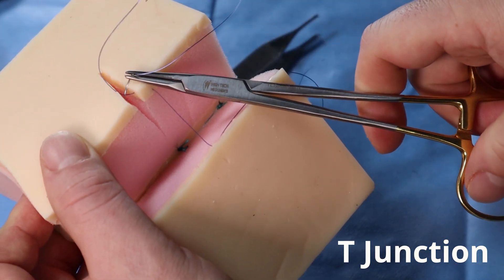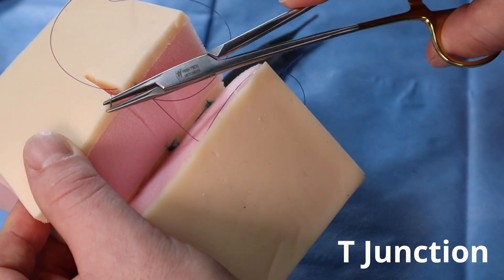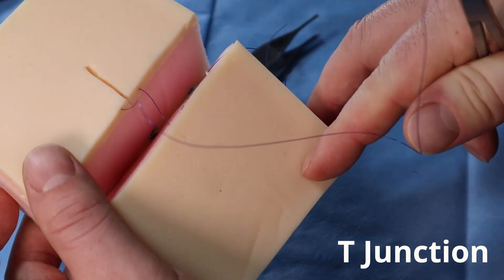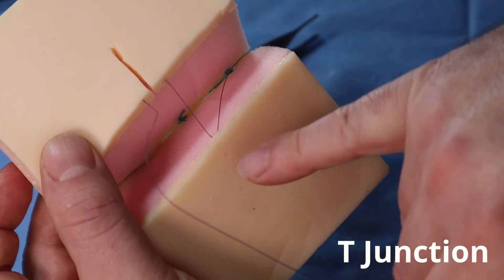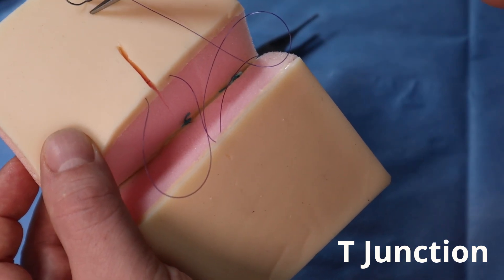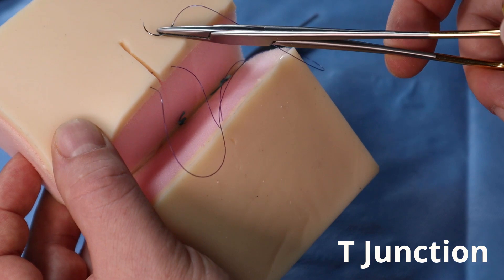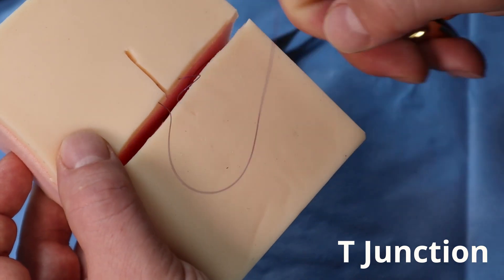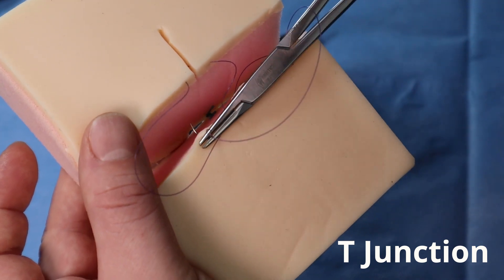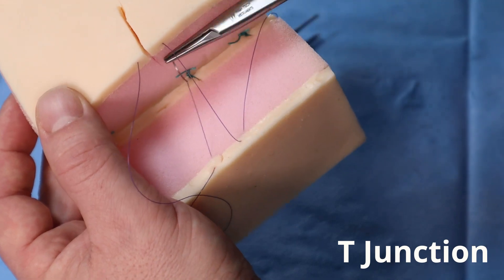And I'm going to go back in superficial here and exit superficial again. And that brings us to our final point. Now, the tail where we started is deep, so I want to finish deep. And I will keep my tails on the same side of this knot. Let me set myself up here for success — a little tricky one-handed, but I think we got it. So we're coming across right about here. I'm going to come in superficially in the middle of the dermis, exit deep — in the dermis, or underneath it.